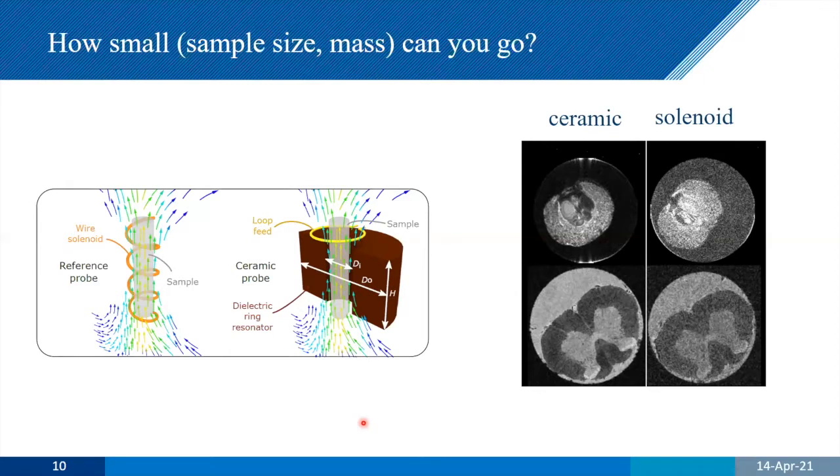And so working with the group in Russia, we're able to increase our sensitivity even further by taking very conventional coil designs and changing that so that we really have here just a piece of ceramic. And that piece of ceramic stores a magnetic field in the middle, and there's no electric field in the center there, which of course means for conductive elements that that's going to increase our signal to noise.